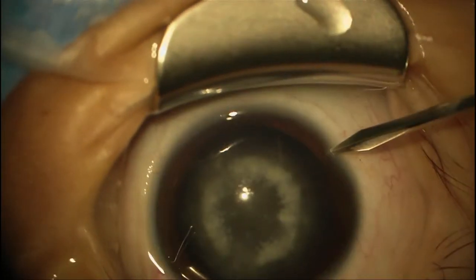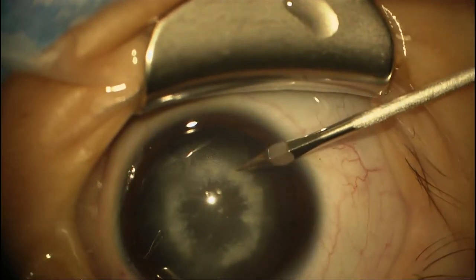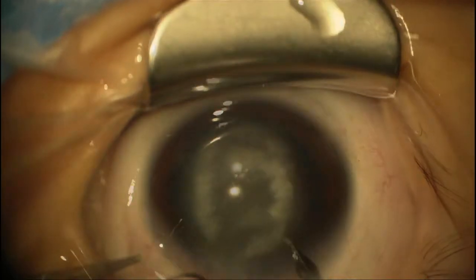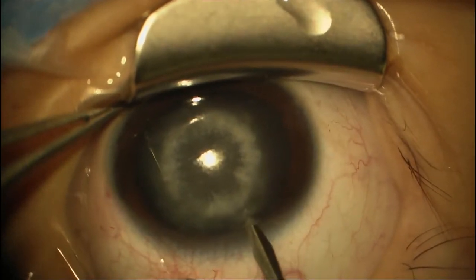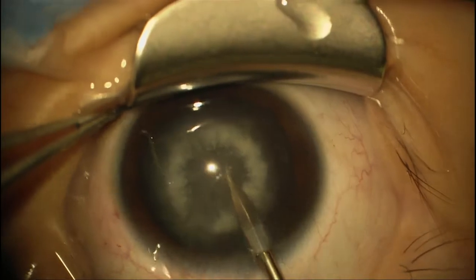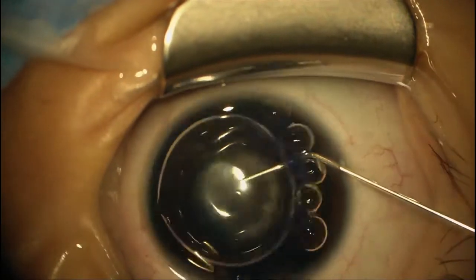This is the sibling of the last patient — a five-year-old girl with a similar kind of cataract, though maybe not quite as liquefied. We're starting off the same way with clear corneal incisions using the MVR blade, and we're going to use the trypan blue to stain the capsule again.